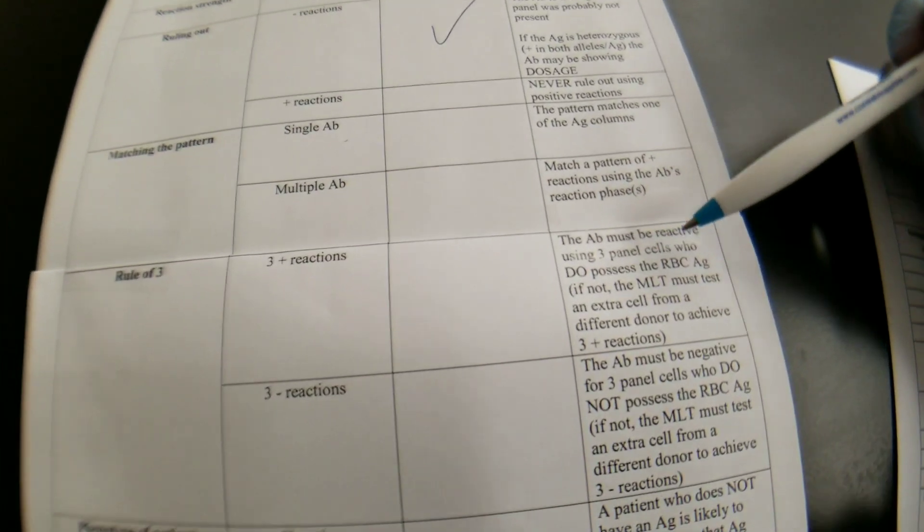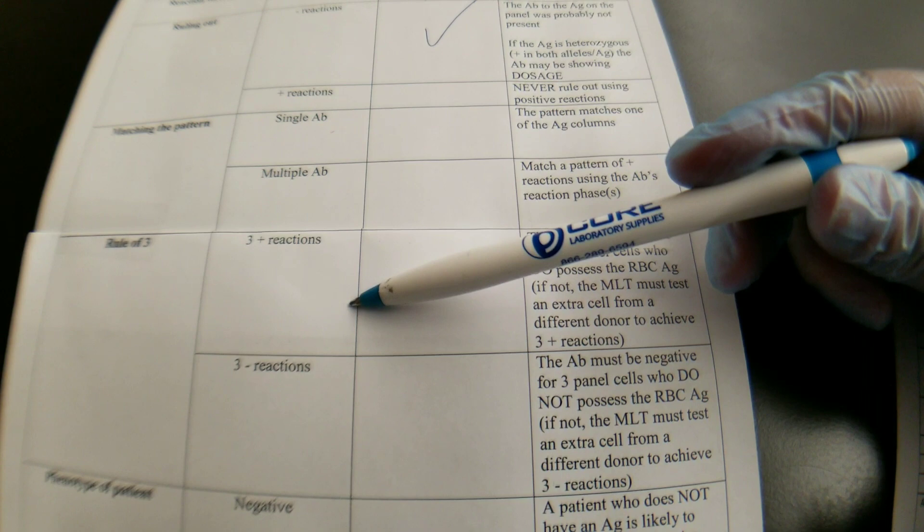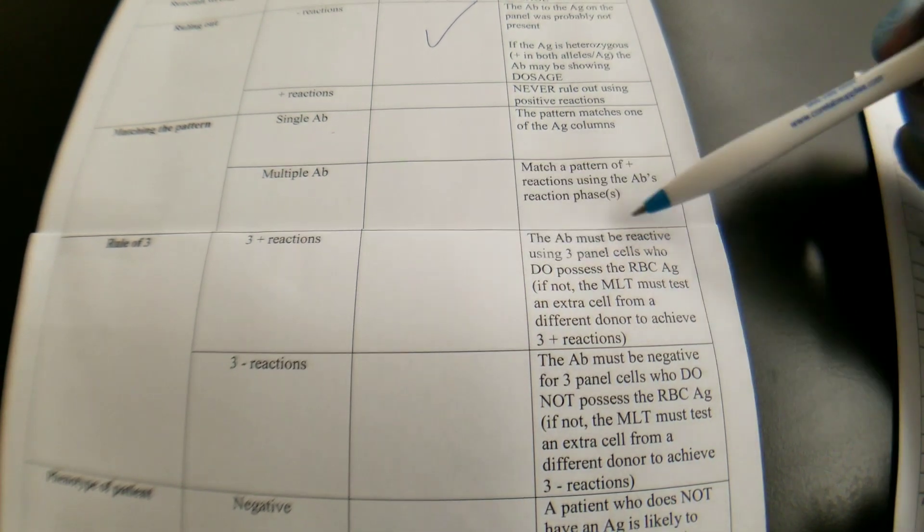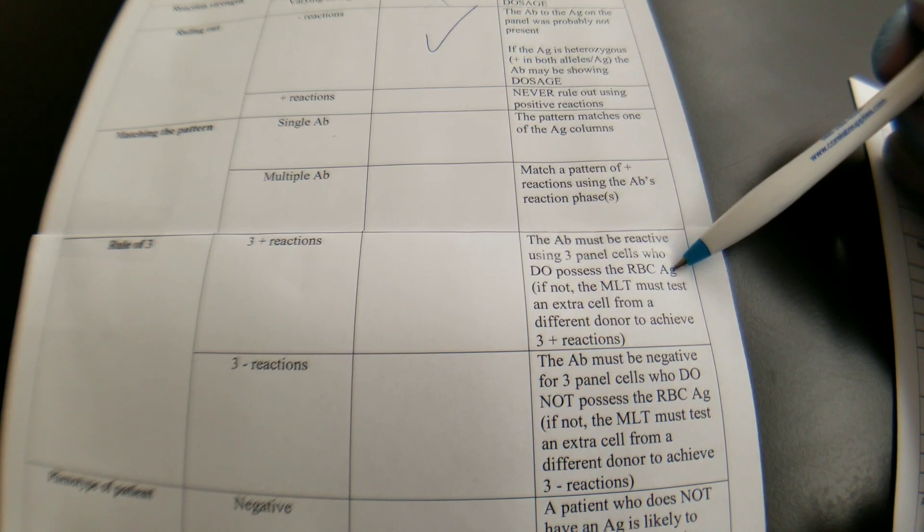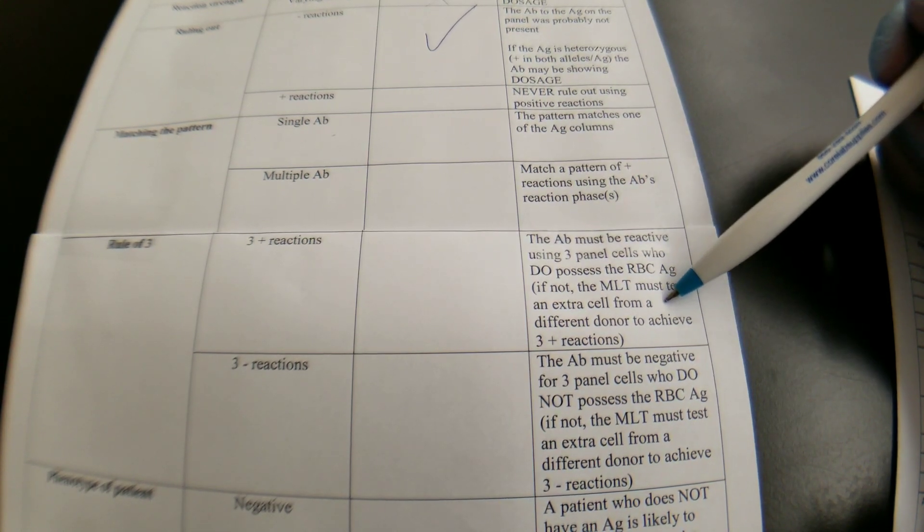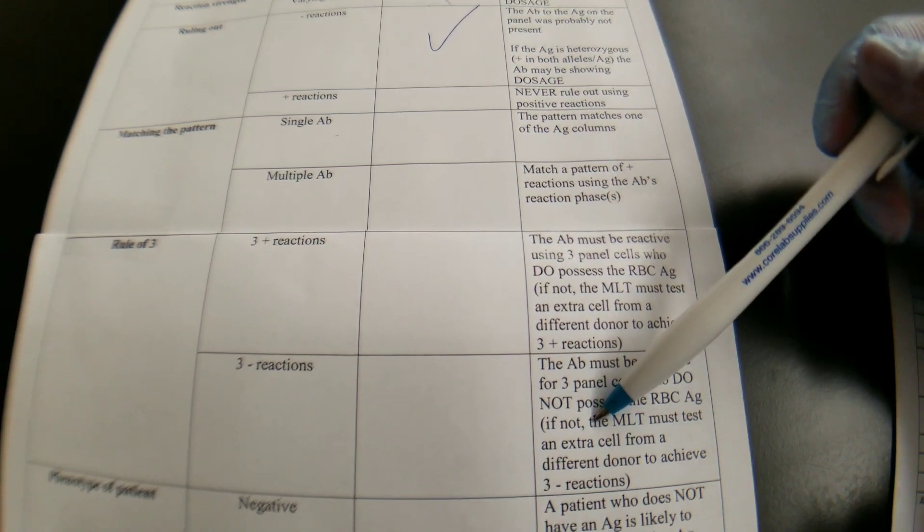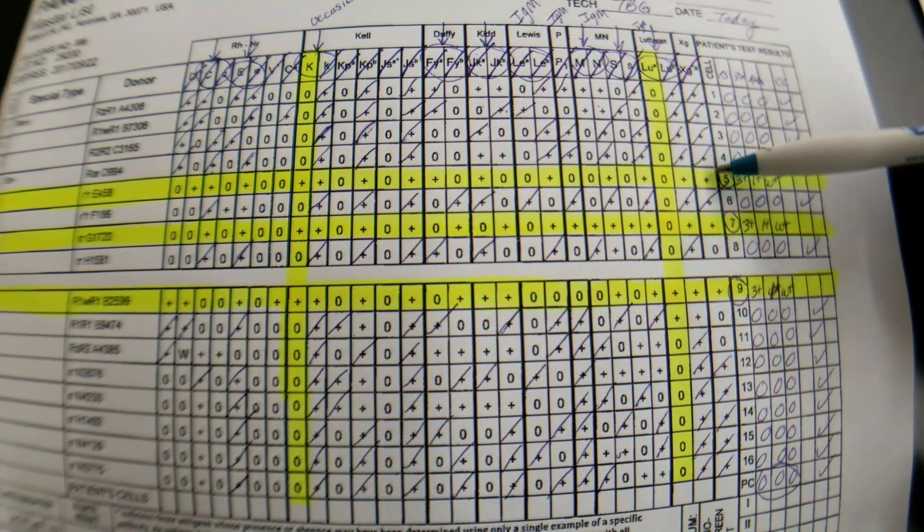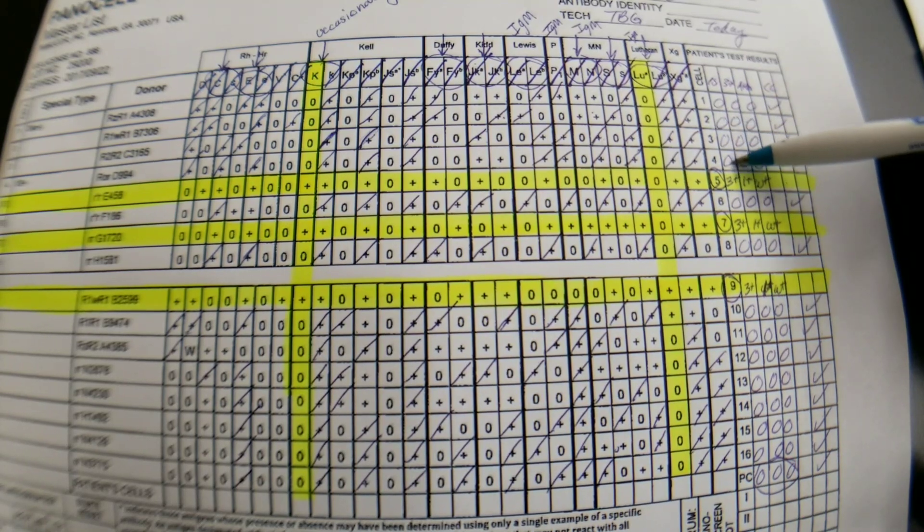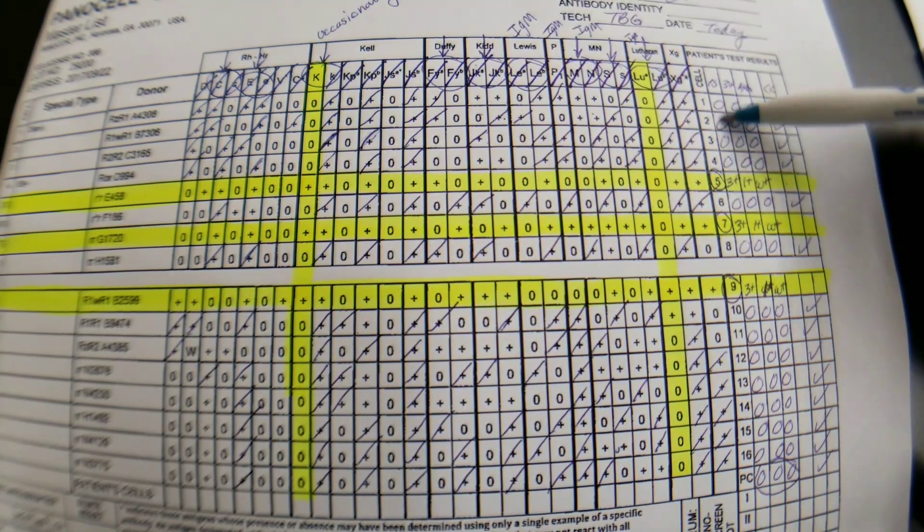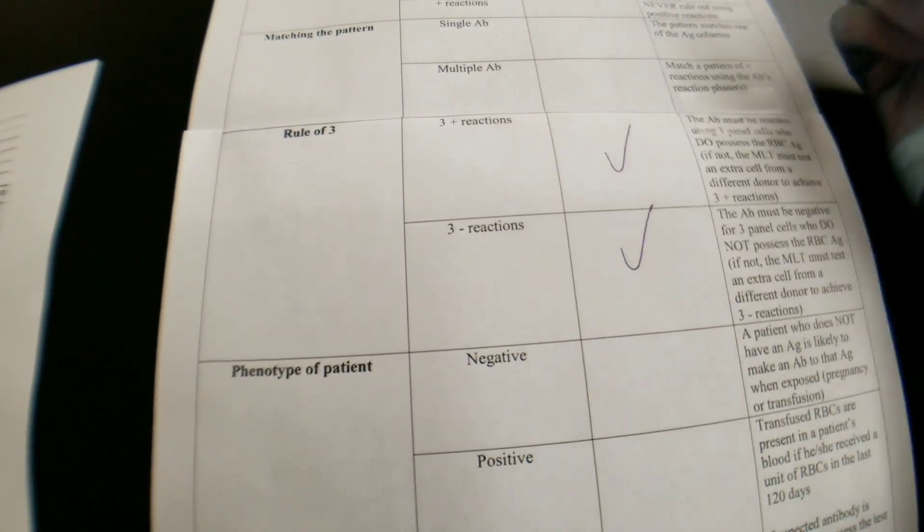Okay, so the rule of three means that, it's written here, that you need to have three positive reactions that the antigen is present in. Okay, so if you read that here, it says the antibody must be reactive using three panel cells who do possess the RBC antigen. If not, the tech must test an extra cell from a different donor to achieve those three positives. And the same thing for the three negatives. Okay, so how many positives do we have? We have three positives. So that's fantastic. And we also have three negatives. Okay, so we do meet that already. Okay, so we can check those off.